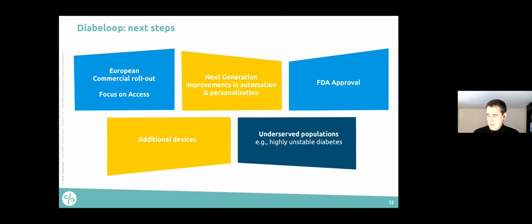We almost call that the at school mode or not at home mode. But basically the system's alarms are pushed down to the bare minimum. You don't need to announce meals, don't need to bolus. The system just takes care of it, fully closed. That way you can be discreet. And if you have that with a patch pump, really, you can be discreet because many people don't want to show that they live with type 1. Other people are fine with it. There's no good or wrong. It's just everyone's different, everyone's preferences.